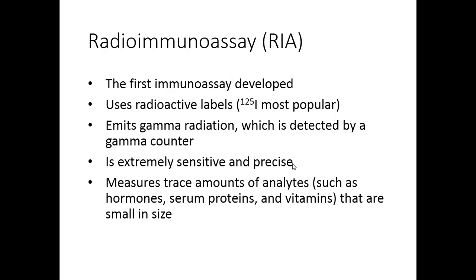And the reason that this is such a terrific test method in a lot of ways is that the radioactive label that it uses, I-125, iodine 125, is really easily incorporated into protein molecules by attaching. It attaches to tyrosine within the protein complex, so it's a simple method of labeling. And as such, it makes the test method fairly reliable.